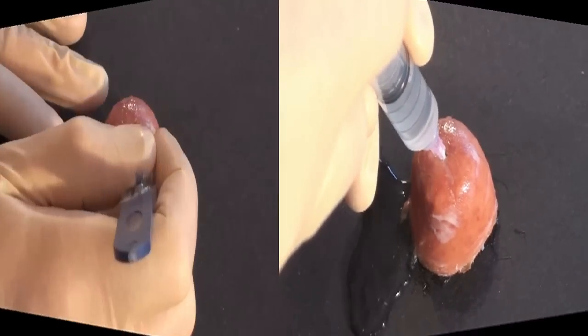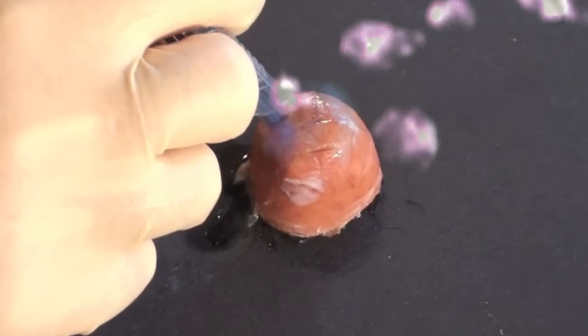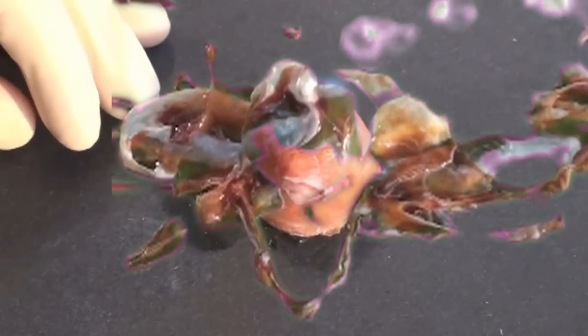Now pull out your I&D kit and set it up while the lidocaine works its magic. Time to slice! Now you've got to break up the loculations, which will still hurt a little bit. Irrigate the abscess if you'd like to do that, and then put a dressing on it.